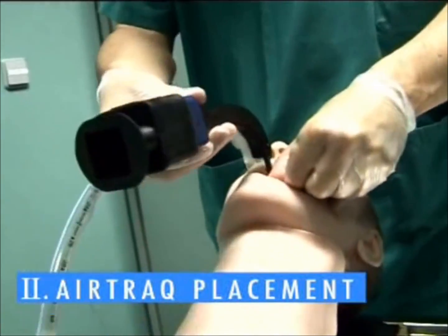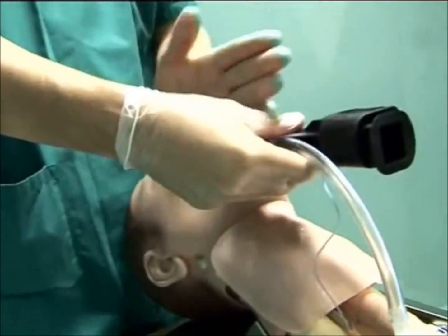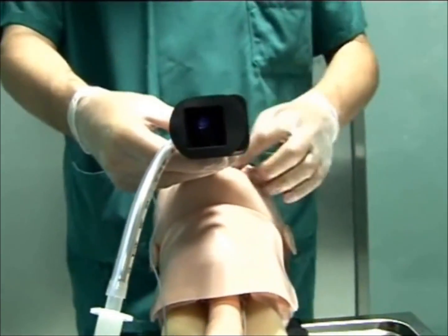Insert along the patient's midline. To avoid pushing the tongue inward, fully insert the tip of the air-track before rotating it up.